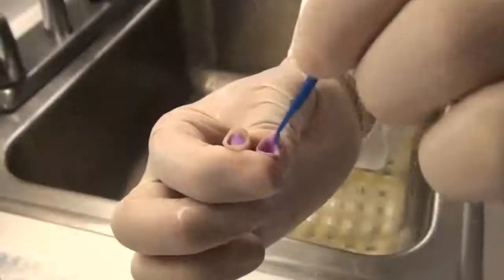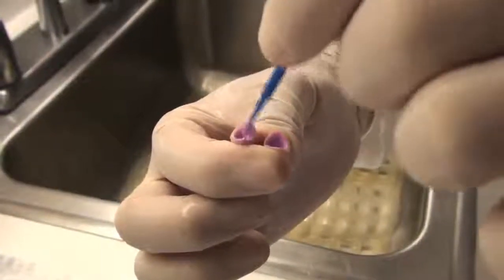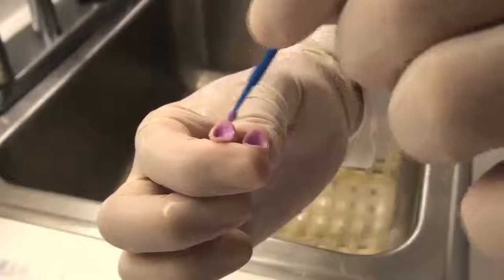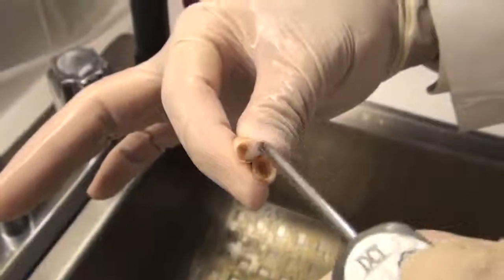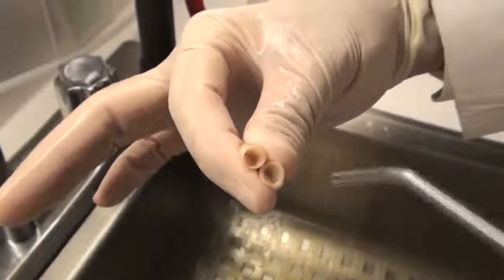So you're going to place it inside of the BruxZir crown or the zirconia-based crown, leaving it for 20 seconds and rinse it out over a sink. But you do not want to be using Ivoclean intraorally because of how alkaline it is.